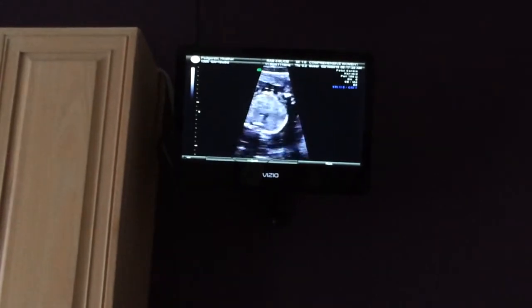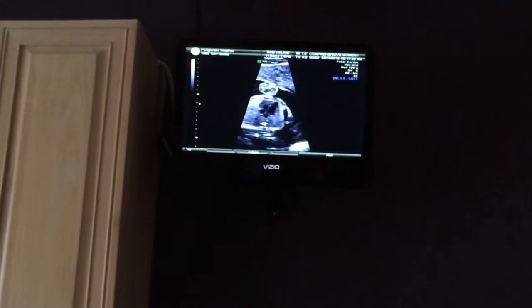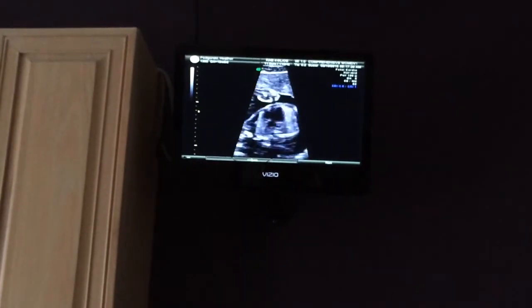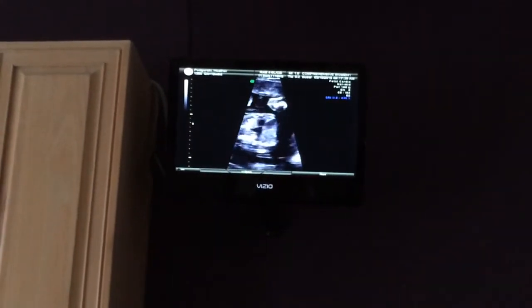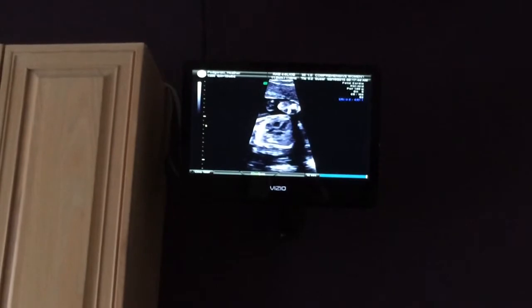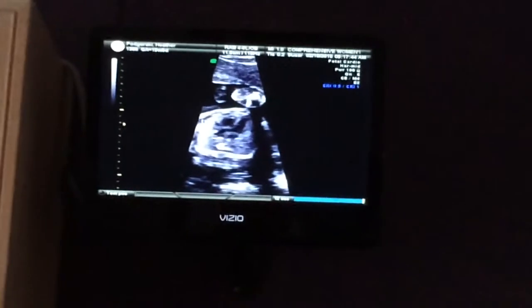I'm just going to look at the anatomy here. Is it crazy that you can see that already? So you can see four chambers — I'm just trying to get around that little arm. See the shadow there? This just shows the left ventricle and the aorta coming off.